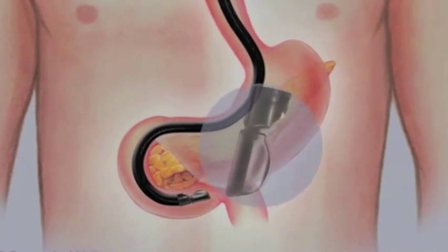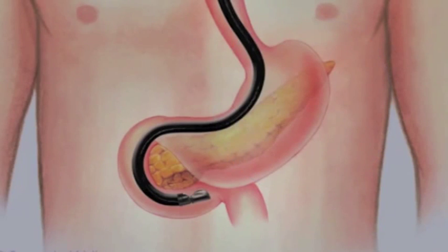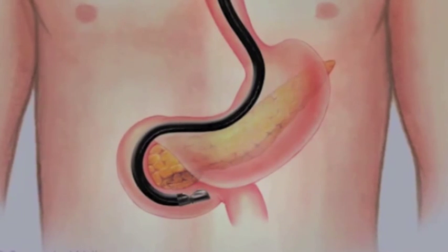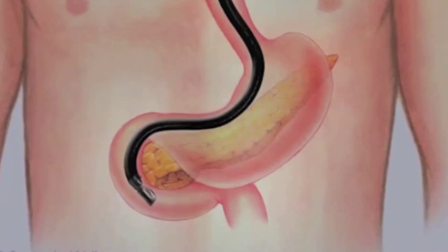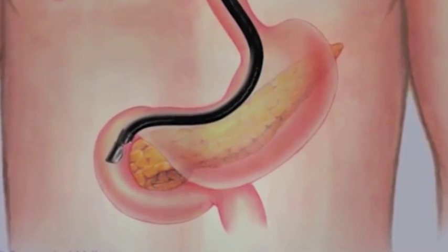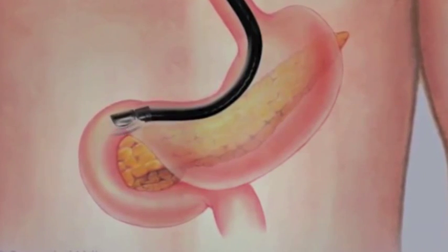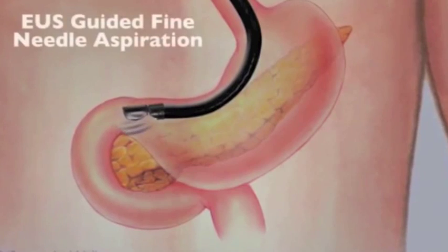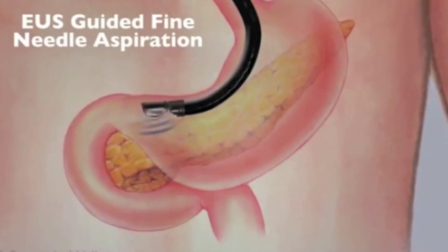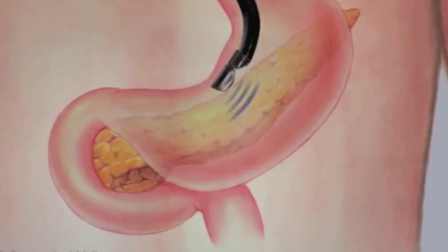At the tip of the endoscope is a miniature ultrasound probe. This probe emits sound waves, which pass through the stomach or duodenum, creating an image of the pancreas. EUS has an advantage over other techniques to image the pancreas because it can be used to obtain tissue samples from abnormal areas of the pancreas. This technique is called EUS-guided fine needle aspiration, also known as EUS-FNA.